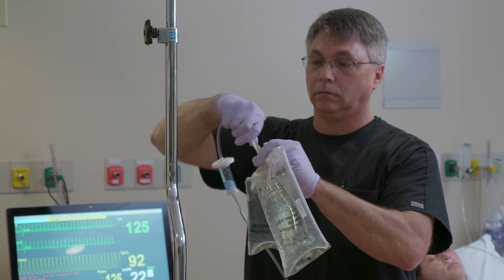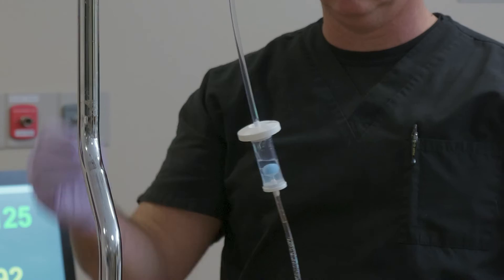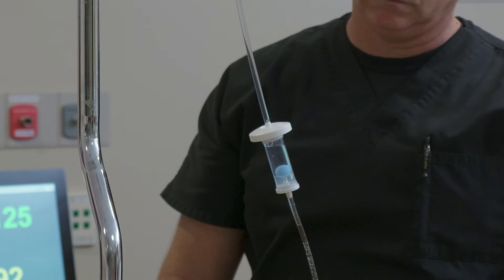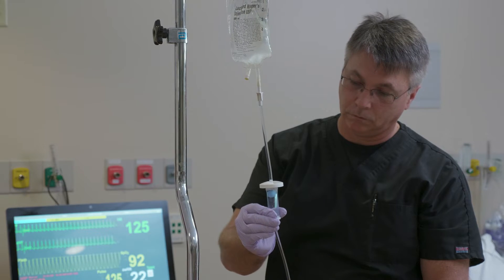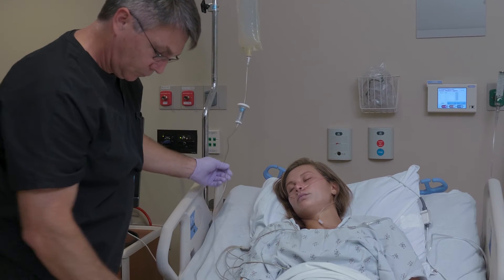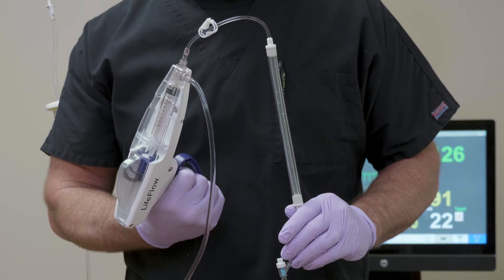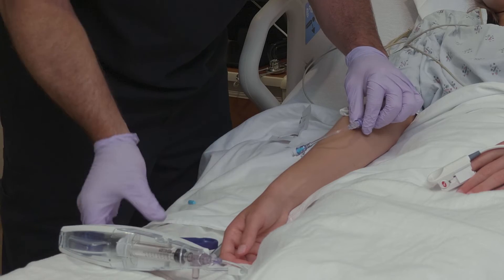First, spike a new bag and wait for the air check to fill completely. Second, squeeze below the ball to release it. The third step is to check for air in the line. Re-prime the line if needed, and then reconnect to the patient.